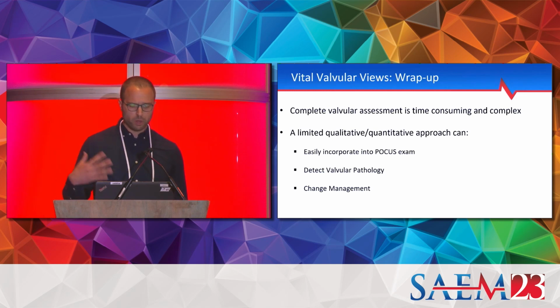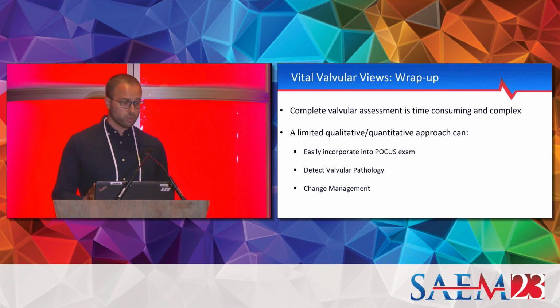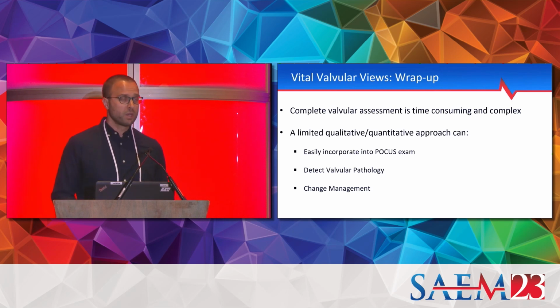As Yo-Yo was saying before, I want to just emphasize that this is not a replacement for your comprehensive exam done by the cardiology department. It is more or less useful for a screening exam to assess whether or not there's the presence or absence of a valvulopathy. Understand that these are just some of the Doppler modalities that are used in a comprehensive exam, and with that limitation, you're potentially going to not pick up every valvulopathy that your patients may have, or you may underestimate or overestimate the severity of disease.